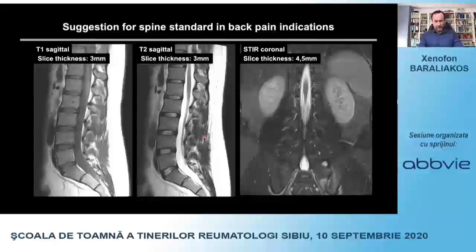This means, again, you can also apply a protocol like this where you screen for back pain and for sacroiliac joint inflammation in those patients who have chronic, this means more than 3 months, chronic back pain, who also are below 45 years. That's not many of them, but still you can screen pretty nicely to get the positives out of the negatives.